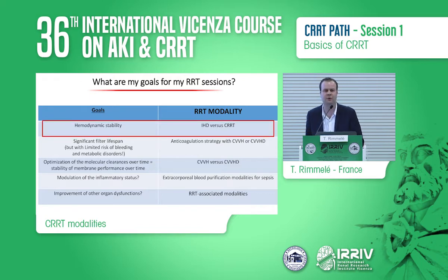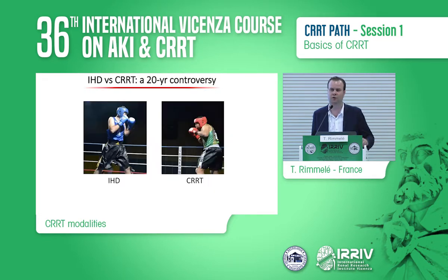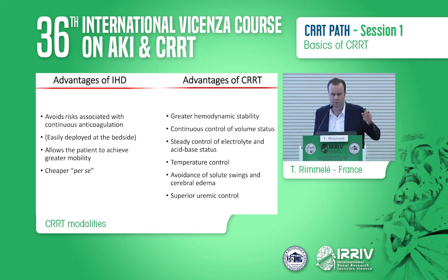So let's talk a little bit about hemodynamic stability. Of course we have this debate, intermittent hemodialysis versus CRRT. It's a 20-year-old controversy. You have advantages with IHD, you have advantages with CRRT. With IHD, you avoid the risks associated with continuous anticoagulation, that's true. You can easily deploy intermittent hemodialysis at the bedside. Well, I have added some parentheses here because I think we have to agree that this is also true now with CRRT, with the new user-friendly machines.